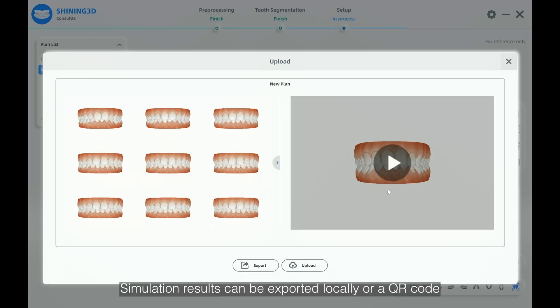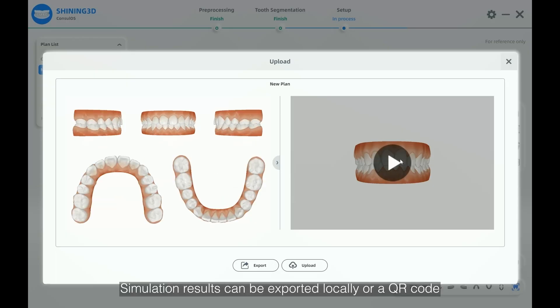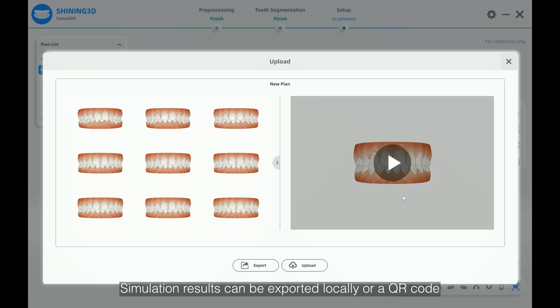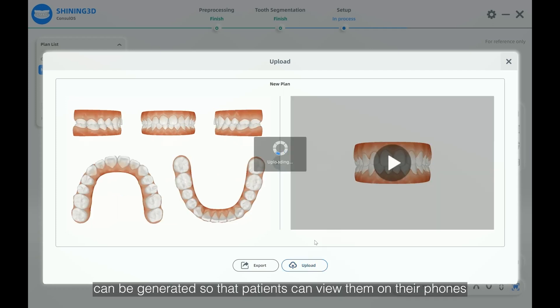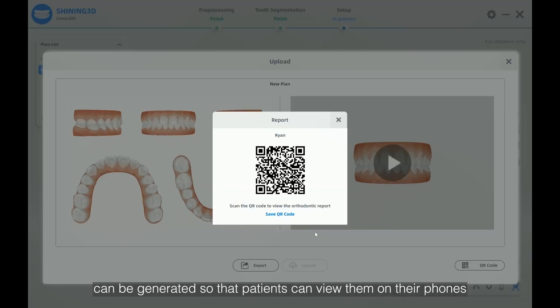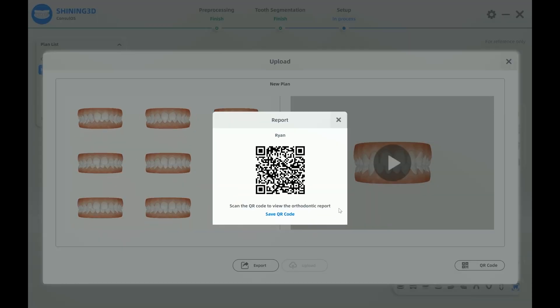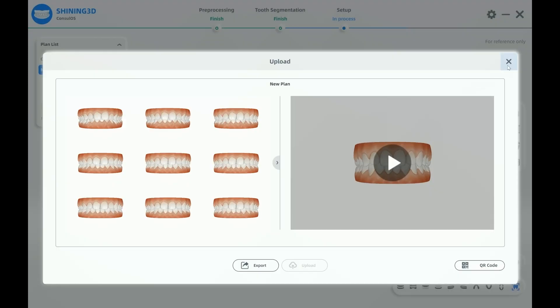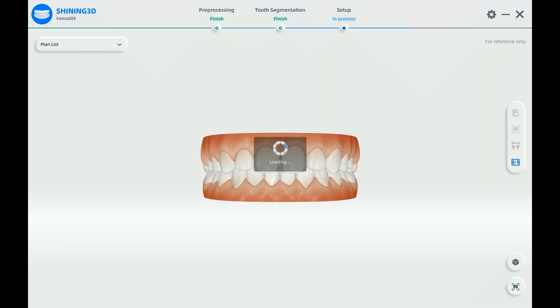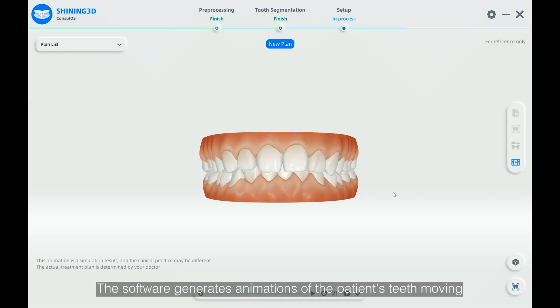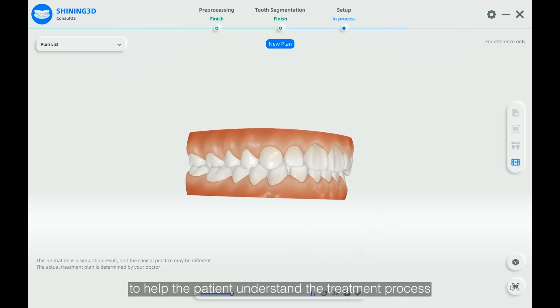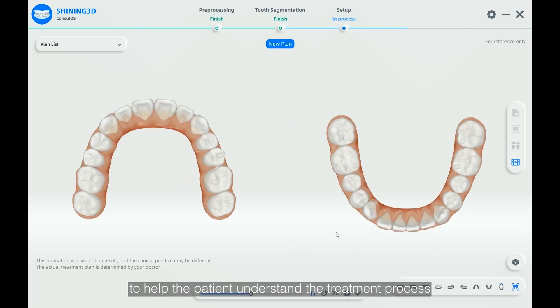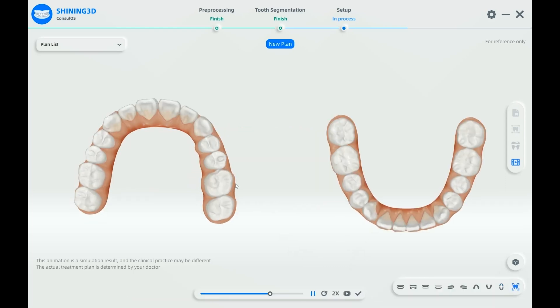Simulation results can be exported locally, or a QR code can be generated so that patients can view them on their phones. The software also generates animations of the patient's teeth moving to help the patient understand the treatment process.